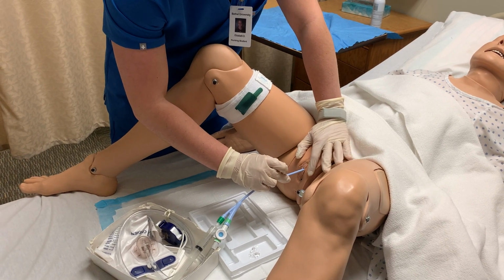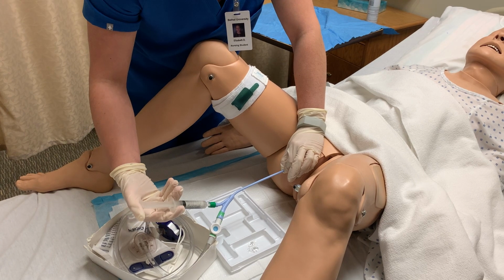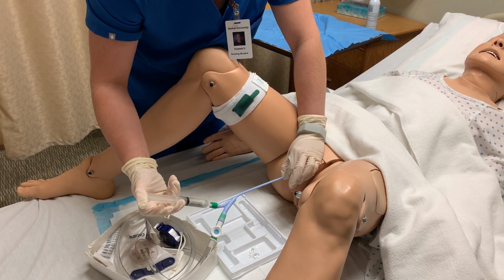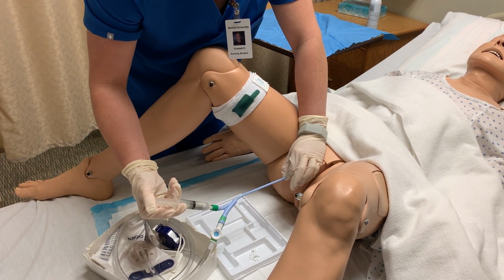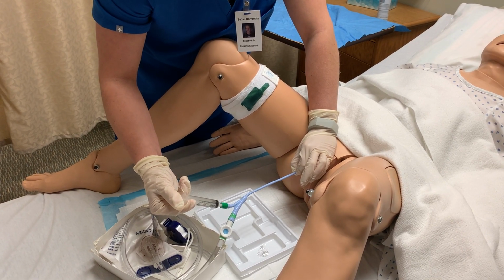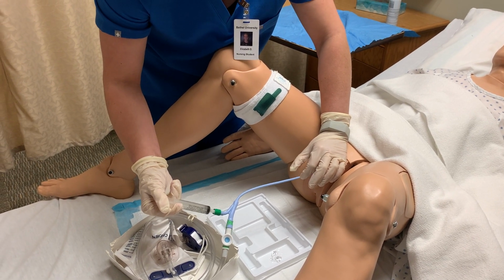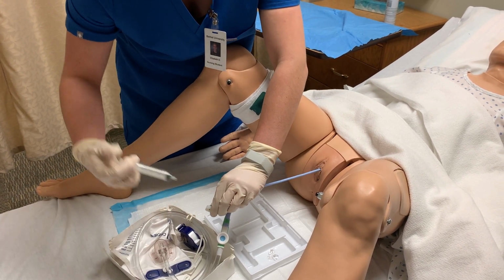Okay, now I'm going to brace my hand and hang on to the tubing here. I'm going to go ahead and give that a slight pull. Okay. And I feel resistance, so I'm going to disconnect.